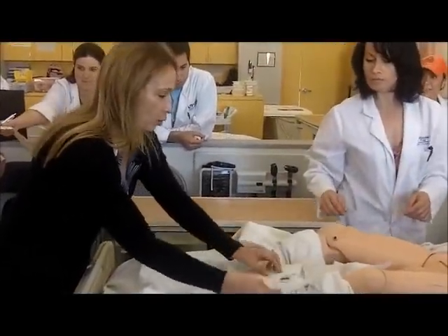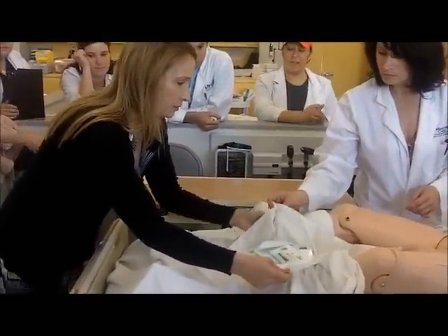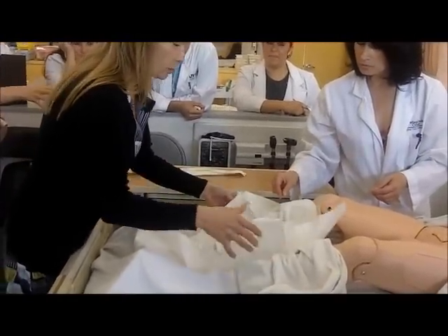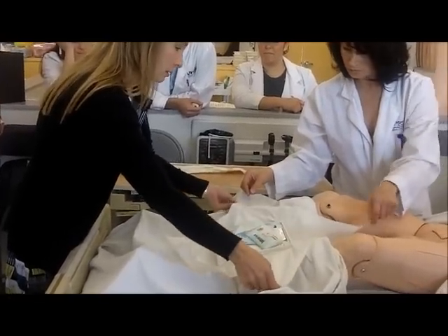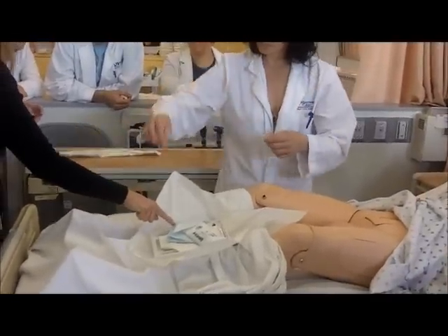I put this here, I open. Remember you can touch this side. The side that you want to really make sure that you don't touch is the place with the catheter. You can touch the bottom side. So grab this from this side here.